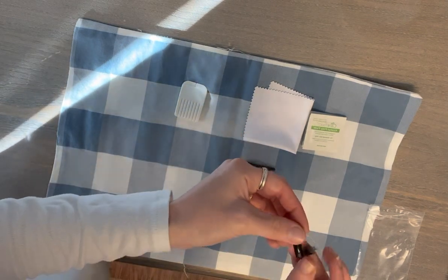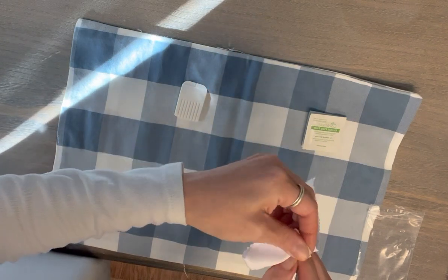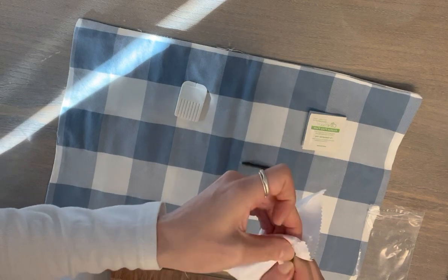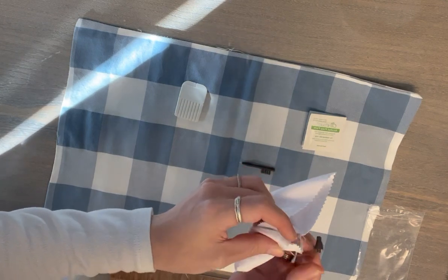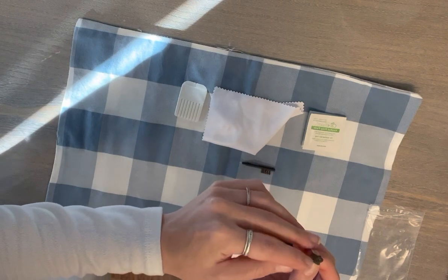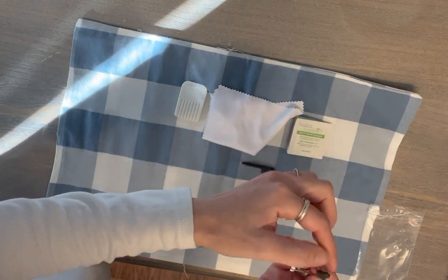Another option is to take the microfiber cloth and just have a better grip and wipe off any debris. It works the same way as the brush, just a little bit of a different method. You can also do that with the body of the hearing aid as well. If there is any sticky debris or wax on the tip, you can use the alcohol pads to wipe off that tip as well.